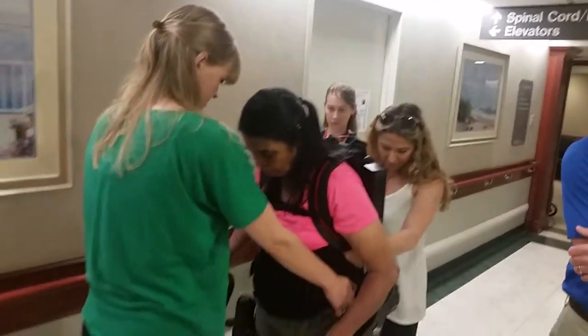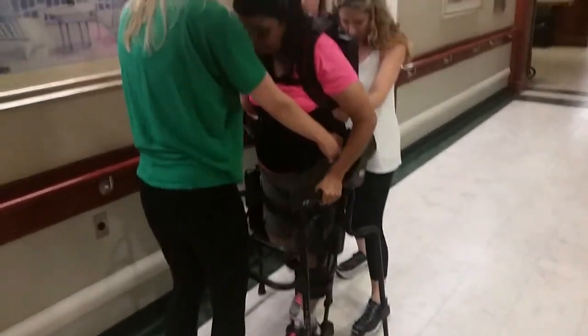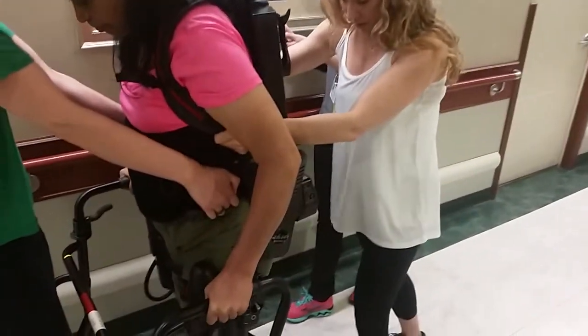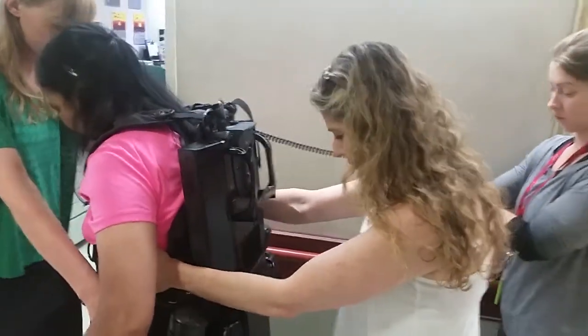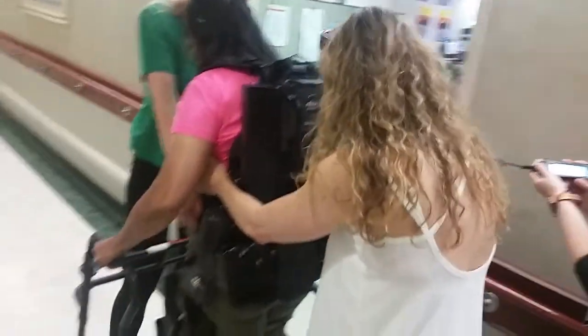Absolutely, and we've got a little bit of a demonstration of the equipment with a patient here at Burke Hospital. It's bilateral, so we need one in the front, one in the back. Good, Mrs. Amin. Thank you. Shift now, come to your right. Come to your right.